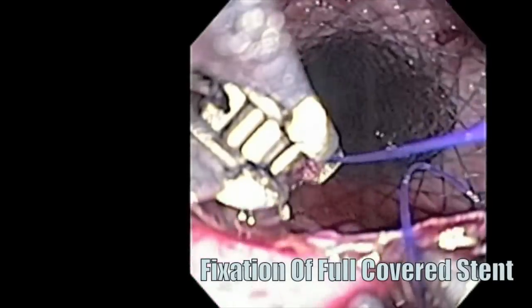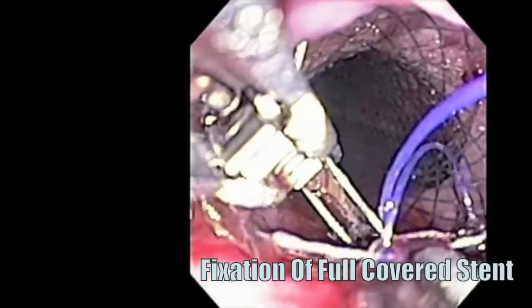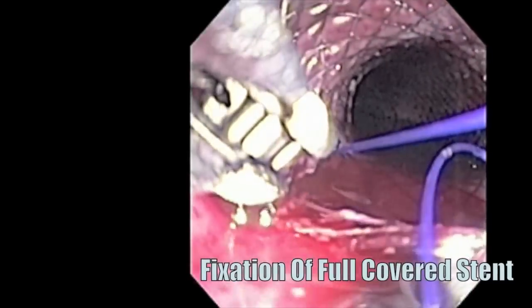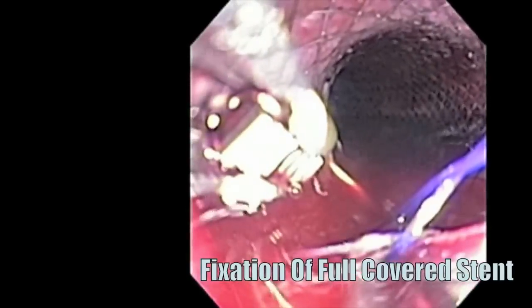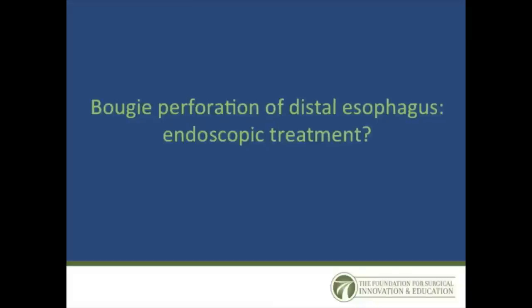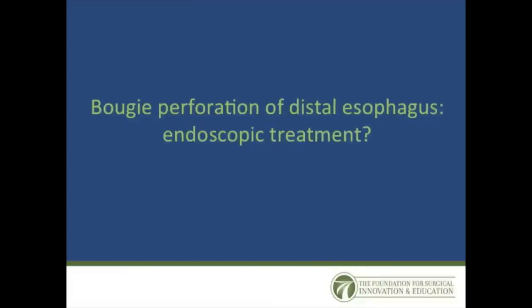As the last safety measure, a fully covered stent was placed over the staple line. The stent was fixed in place with the overstitch to prevent migration. Now, what are the options for a delayed presentation of a perforation of the distal esophagus by the bougie?